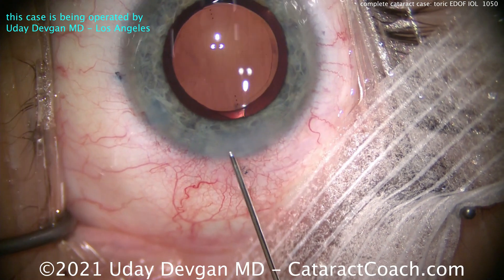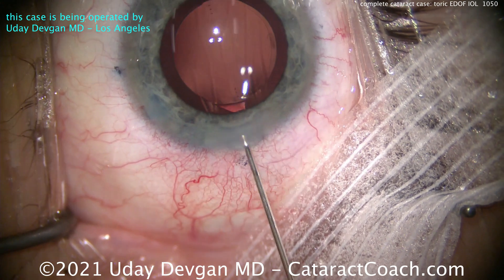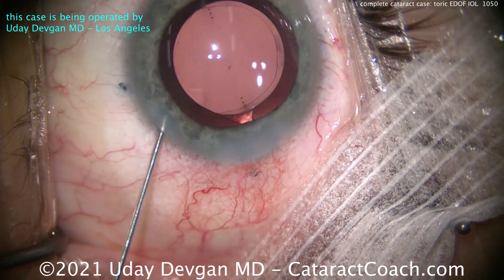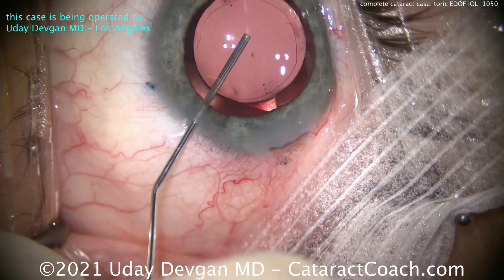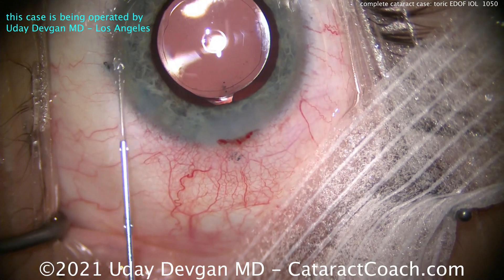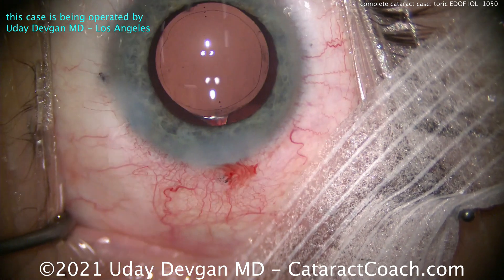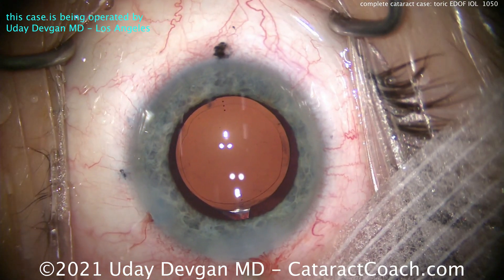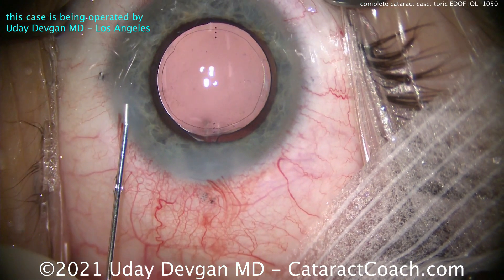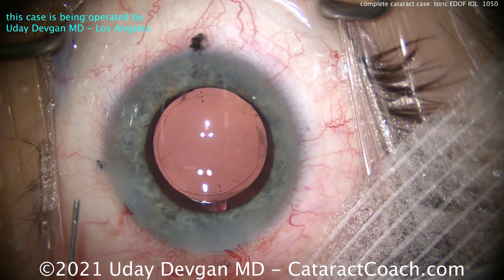You spent so much time preparing for this case — this is the critical part. Spend the extra moments getting the lens position as perfect as you can. Take your time, flush out that viscoelastic, seal up the incision, and really make sure the lens is well positioned. You want that optic to overlap for 360 degrees under the capsulorrhexis. Now look at the Purkinje images lined up to avoid parallax — they are right in the center of that beam-shaping element of the optic. And the toric marks are exactly lined up on the steep axis. Just perfect lens position.